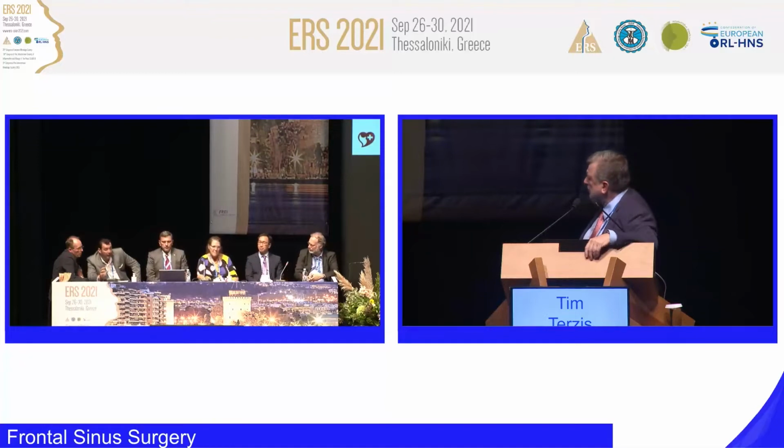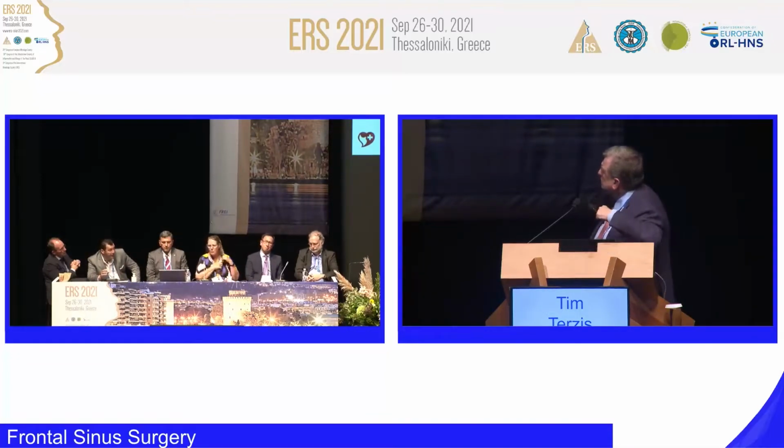The only thing I saw on the sagittal CT is a very well pneumatized frontal sinus on the right side. And maybe it's like a mechanism of pneumosinus there because of that agger nasi cell. This will be the only indication for the moment to remove that agger nasi cell. Otherwise, treatment will be very good.